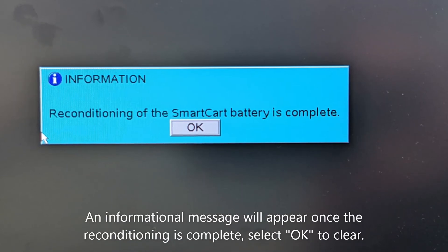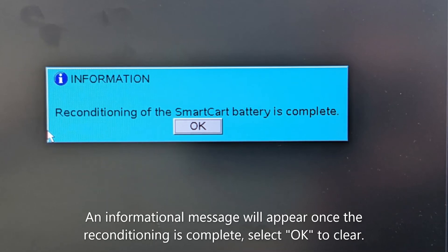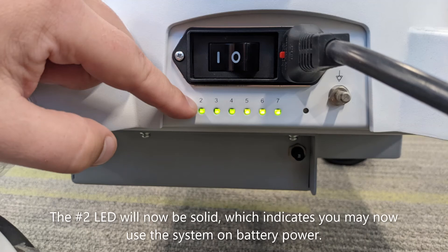An informational message will appear once the reconditioning is complete. Select OK to clear. The number 2 LED will now be solid, which indicates you may now use the system on battery power.